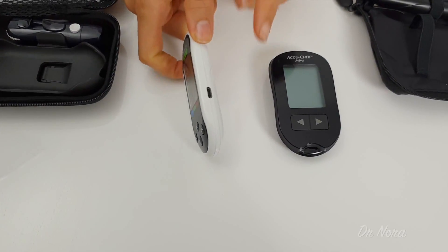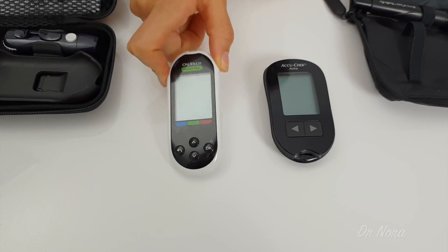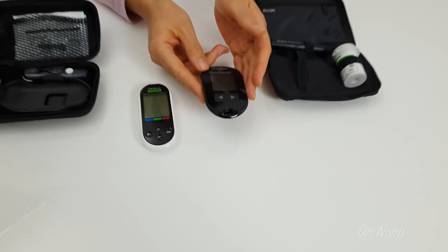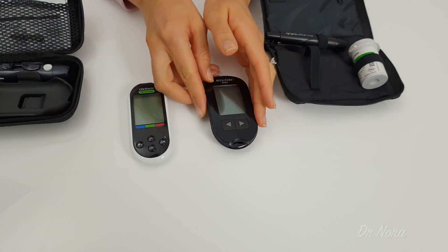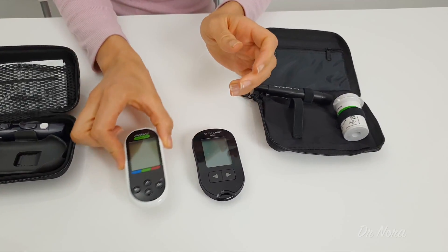It also allows you to plug it into your computer so you can download your sugar readings through a USB device. Now the biggest similarity with all of these, and probably the most important part, is the testing strip area. For this one it is placed here, and for this one it is placed here — and this is where your testing strip will be placed.